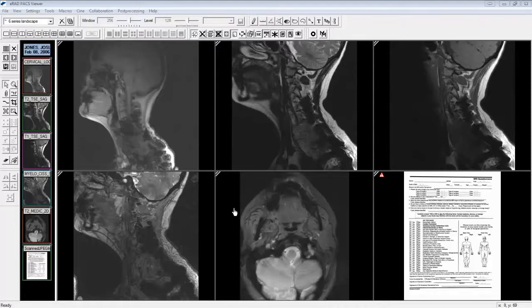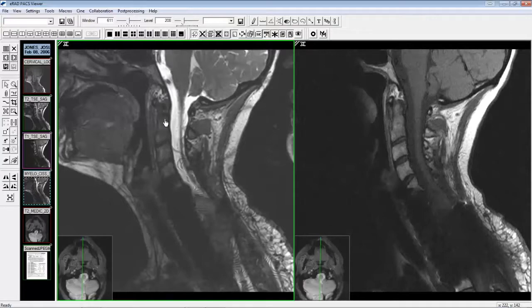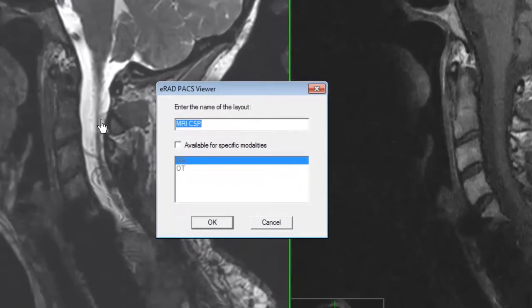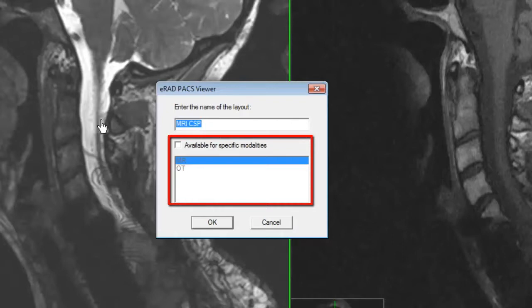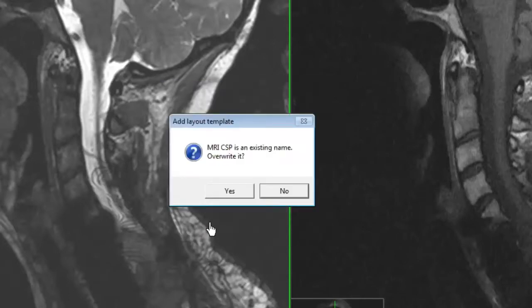To resave and overwrite an existing Hanging Protocol, follow these steps. Apply the existing Hanging Protocol. Make desired changes to layout, image frame content, window level, zoom factor, or image linking. Click the Save button on the Template toolbar. You should see the previously selected Hanging Protocol name already populated. This is needed in order to overwrite the existing Hanging Protocol. Notice you have an option to make this Hanging Protocol available for specific modalities only. This is a new feature that will reduce the amount of clutter in the Template toolbar drop-down menu. Acknowledge the overwrite prompt by clicking Yes.